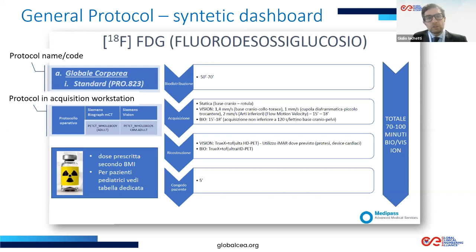So the technician has to know what has to be launched on the acquisition workstation, and that is related to the protocol. It's important to know the radioactive dose, so how we quantify the dose.